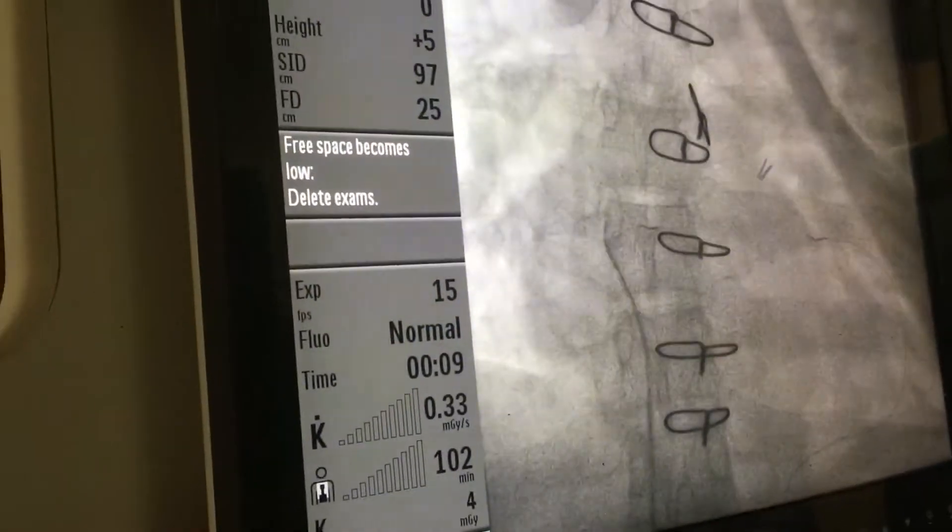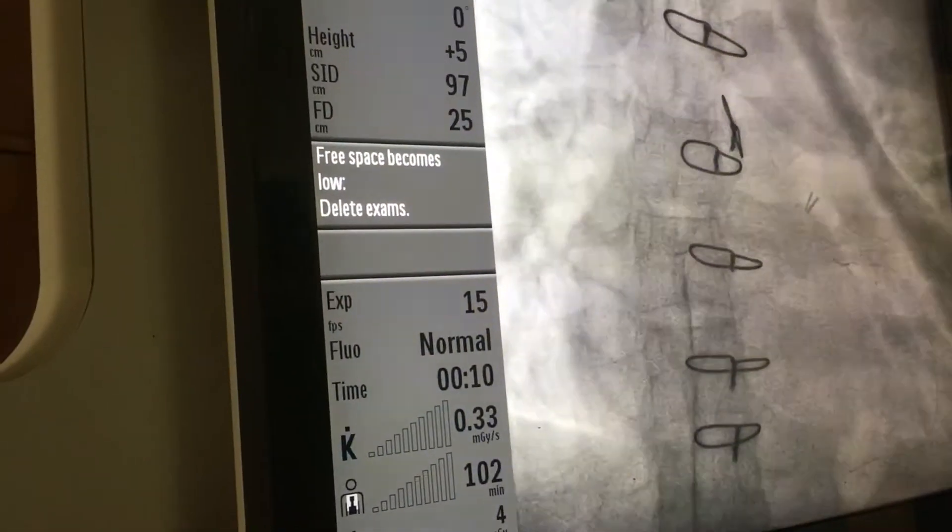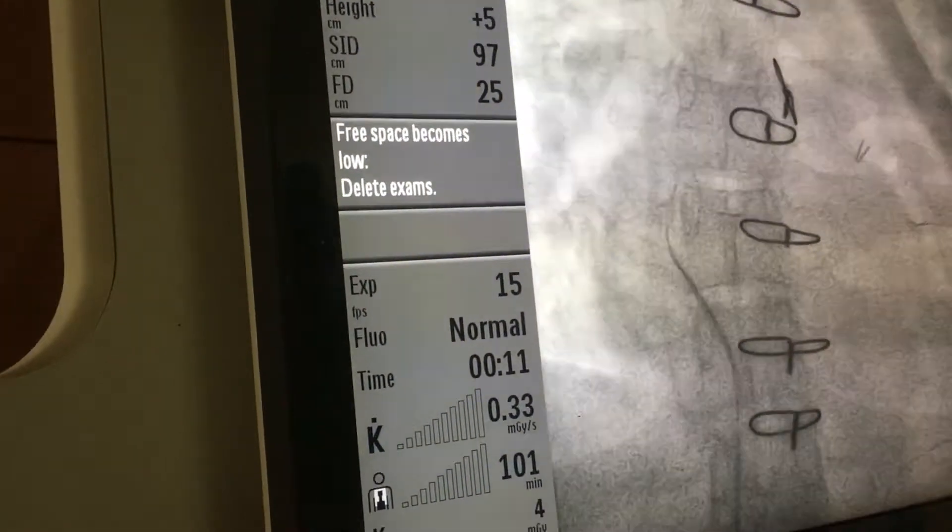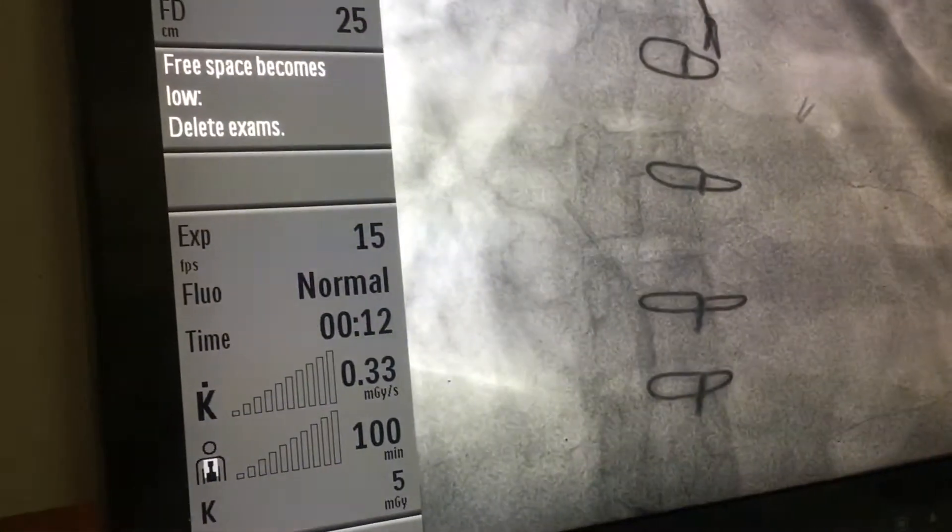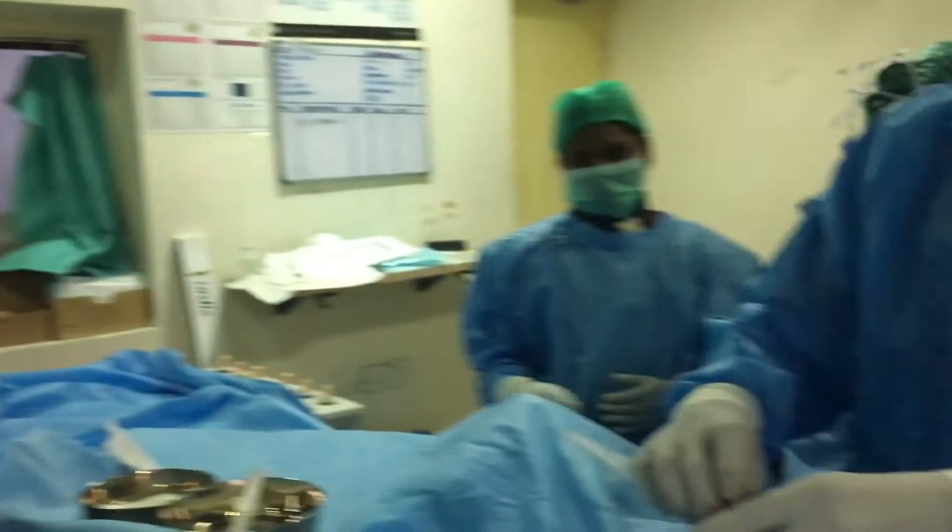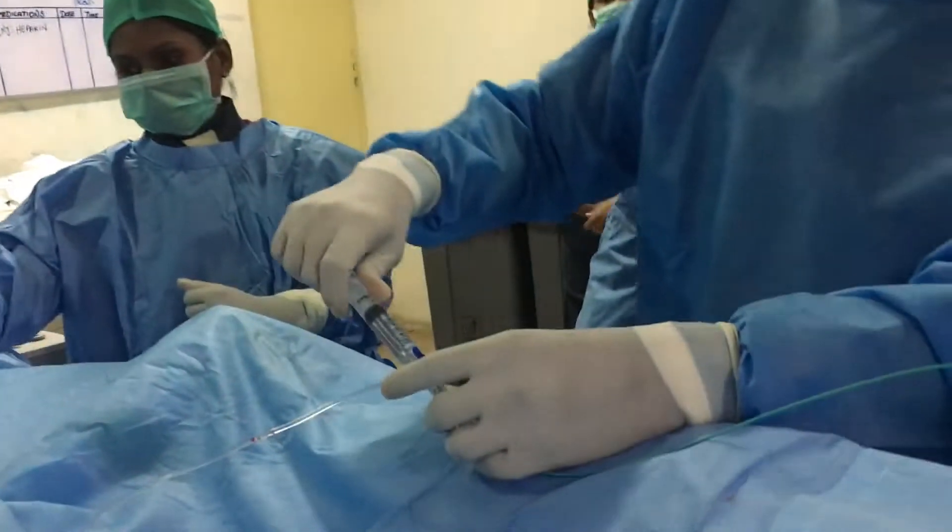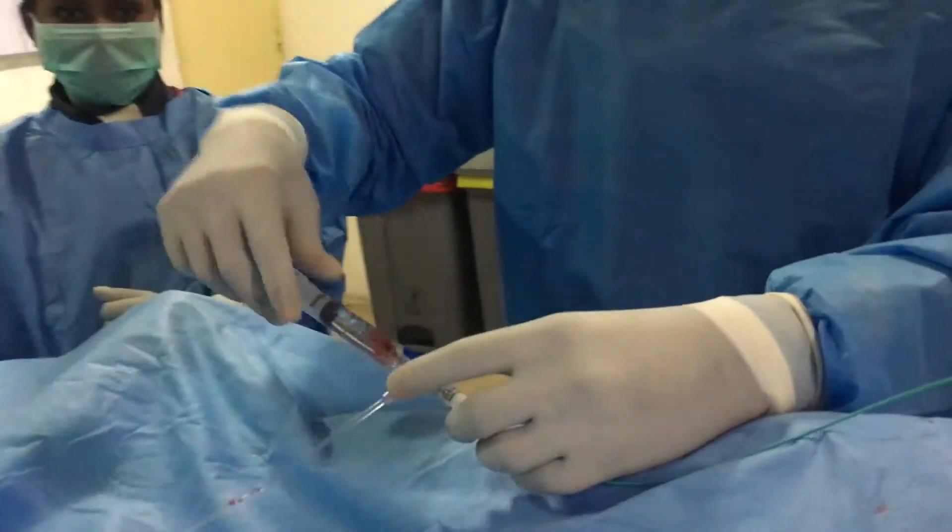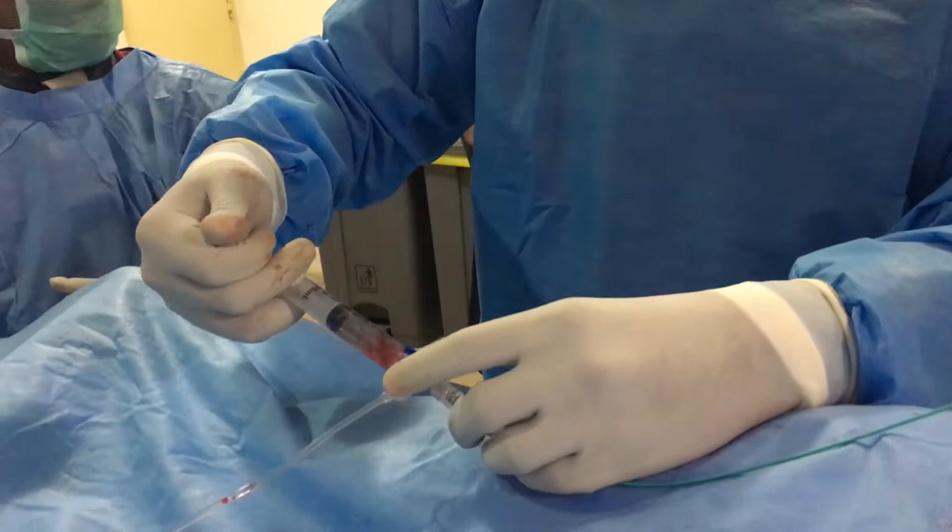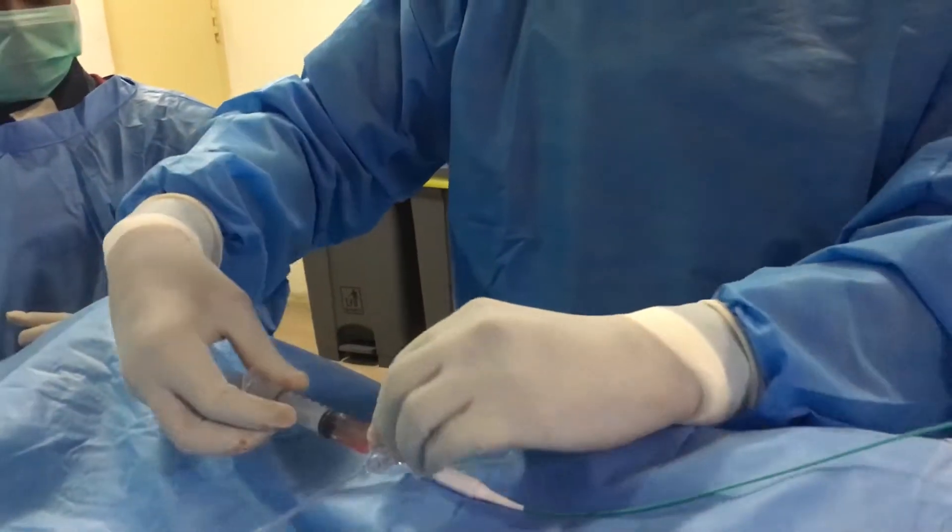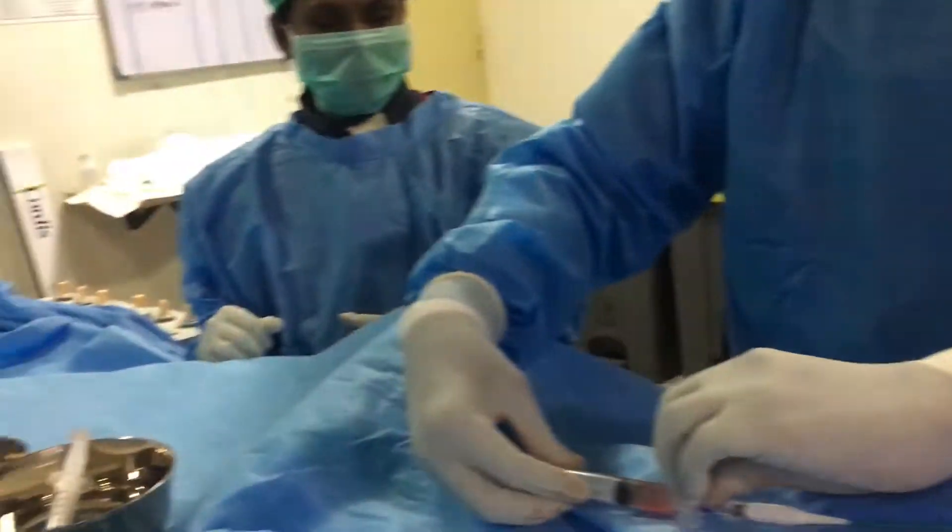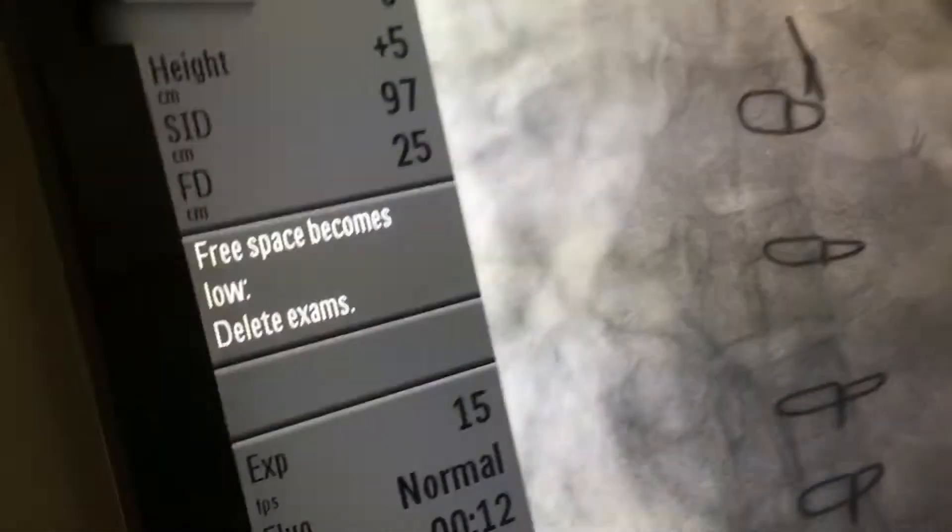Okay, so we have reached RA. So we usually do a pressure measurement also. Make sure the right heart catheterization is done during biopsy. This is a post-transplant patient, so we would like to know what are the pressures of the transplant. He has undergone heart transplant, he is almost 10 days post-transplant.